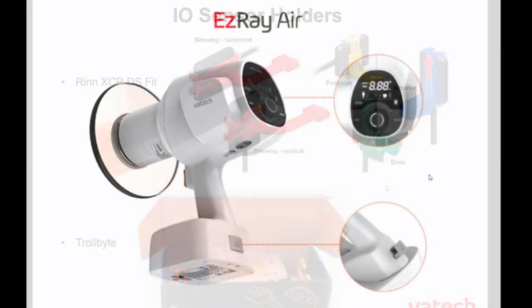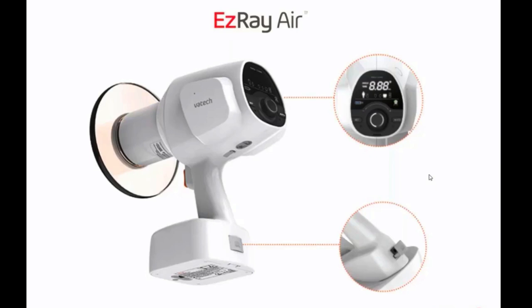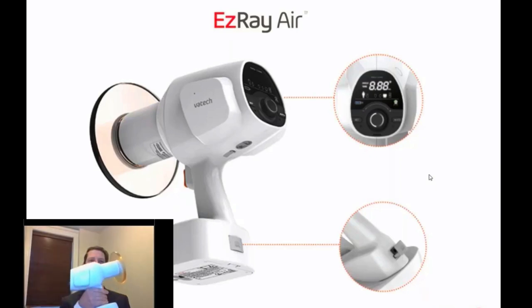Let's talk about the easy ray air handheld x-ray. I do have one here — it is about 3.75 pounds, which is about 30 percent less than other handhelds on the market. One thing I really like about this is it sits flat on the table, so you don't have to set it on its side. It does sit flat. We do have our on and off switch here.